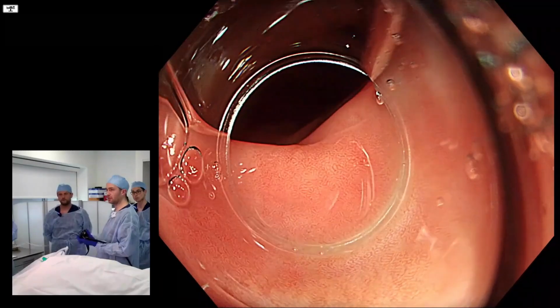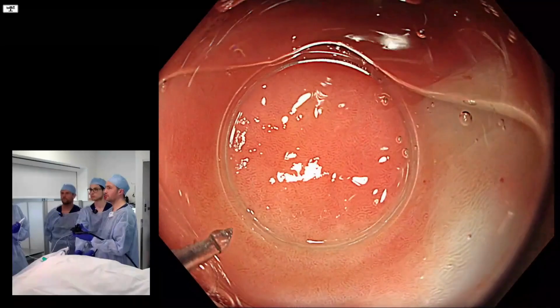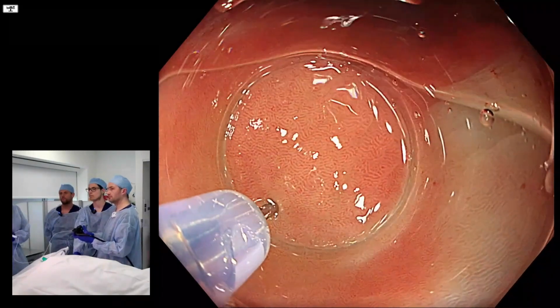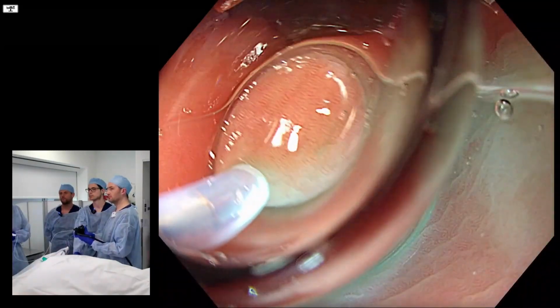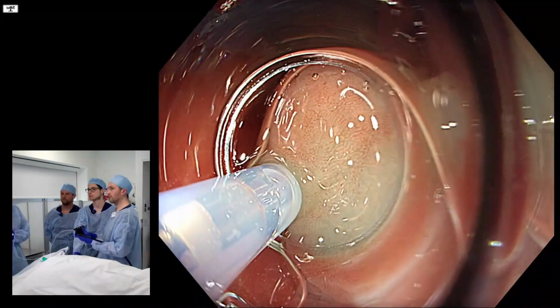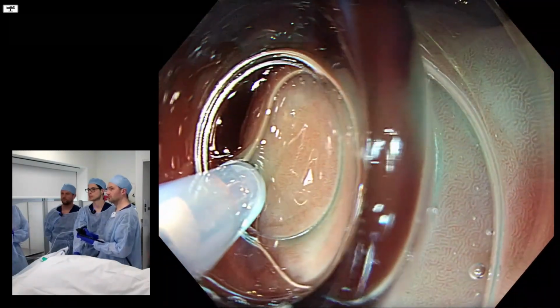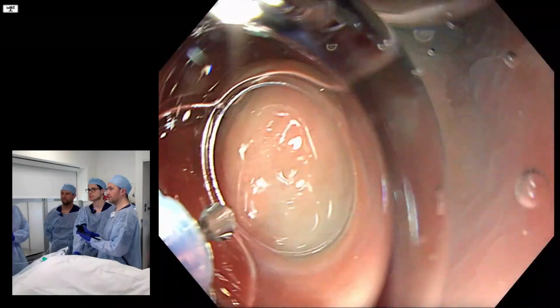Can I more easily get the knife in here in retroflexion? Let's have a look. Yeah. Oh, very easy. Go now, Molly. This looks definitely better. Go, go, go. Okay. And again.